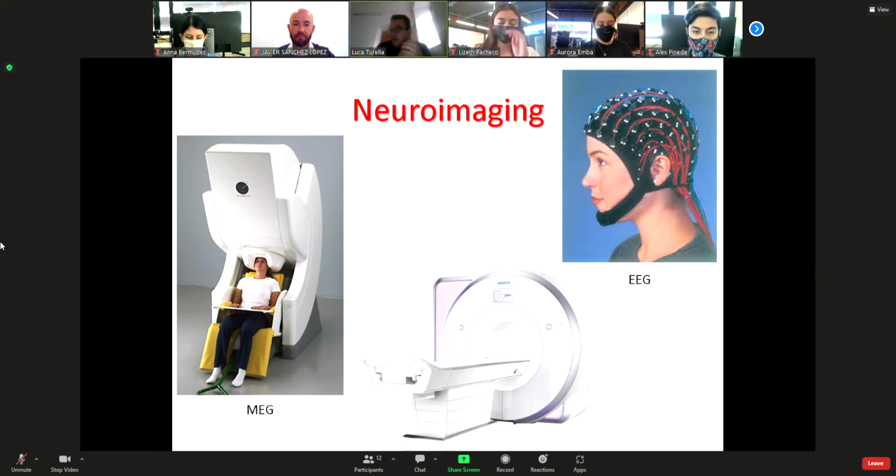The time of the MRI acquisition of the entire brain is like 1 or 2 seconds, but even the signal that you measure with fMRI is very slow. So this is one of the first differences between the two: the type of application that you can do is defined by the type of signal that you are measuring. And this is what we will see also later on.